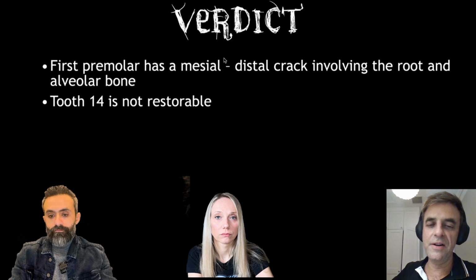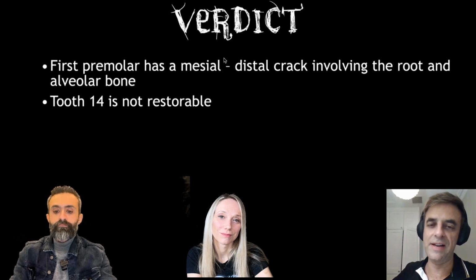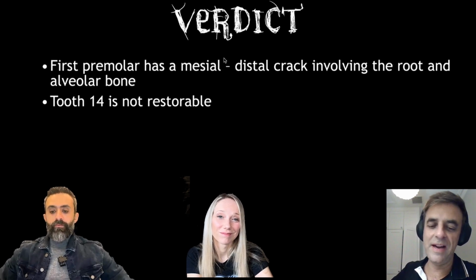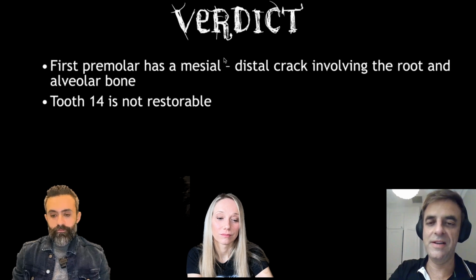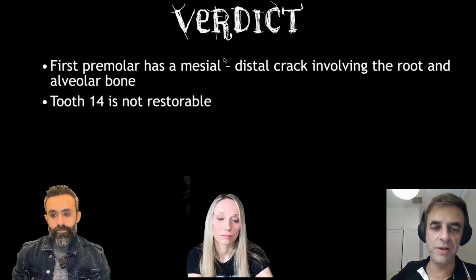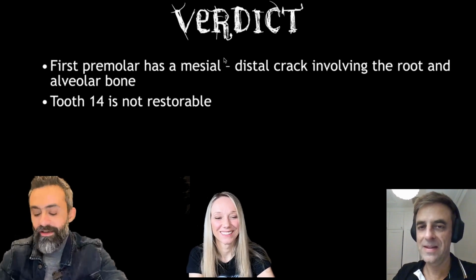Gone are the days where the patient used to go get their tooth looked at, and the dentist used to open up the tooth and say it's unrestorable, there's a crack, and then put a temporary in there. The patients used to leave, and they used to say, but my tooth doesn't hurt anymore, and he says it's not restorable. But now we can show them on the screen. We can show them on the CBCT while we're in the surgery, and it's really, really good for the patients to see this. So this tooth isn't really restorable, so the patient's going to get the tooth removed and hopefully move on with replacement. We can't save them all, unfortunately. Definitely, we cannot save every tooth.